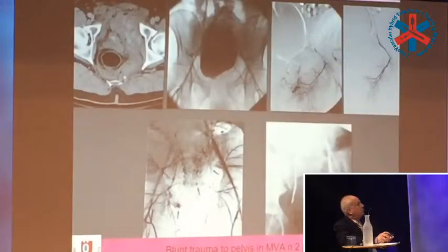This is important: pelvic bleeding, massive bleeding from everywhere. What we do is just selectively catheterize both sides with 2 teams, embolize everything there without impunity in the young person, and then you have to embolize with particles or gel foam. I don't think the ballooning, the REBOA, is going to work in here because the bleeding is from collaterals. Nobody has discussed this in here.